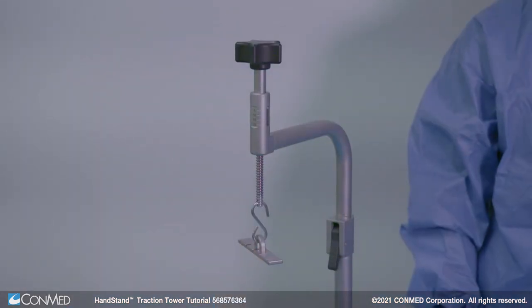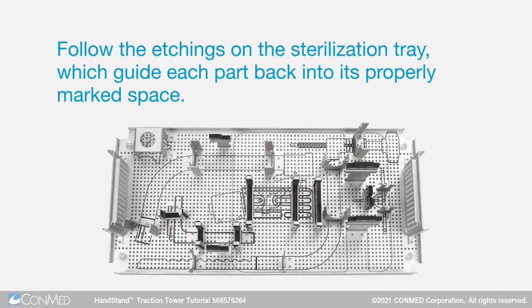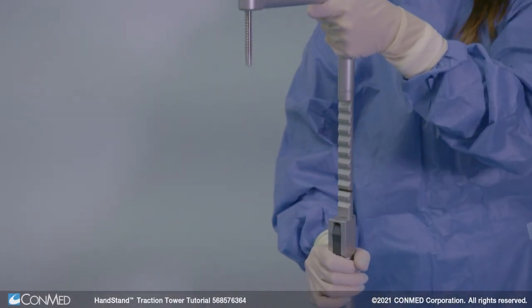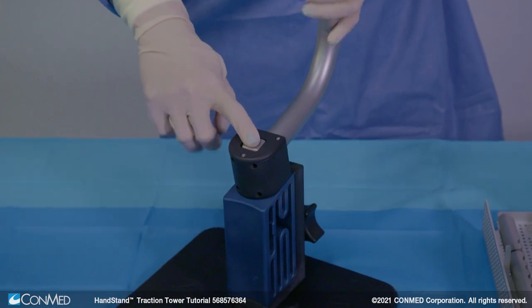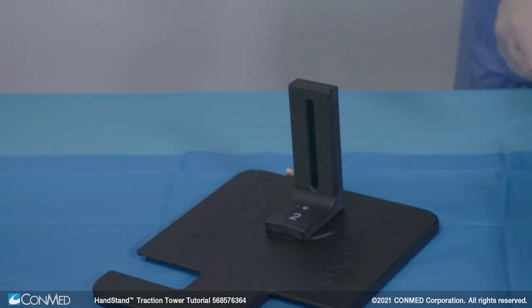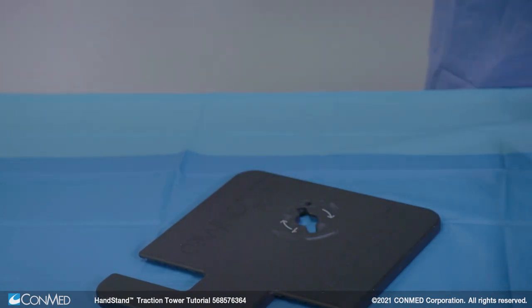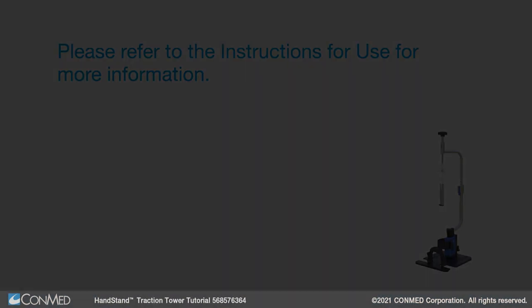To disassemble the tower, first remove the scale rack from the threaded rod in the upper arm. Follow the etchings on the sterilization tray, which guide each part back into its properly marked space. Next, depress the black lever on the lower arm and remove the upper arm. Then depress the silver button on top of the upper tower to remove the lower arm. Remove the tower locking knob, which releases the upper tower from the lower tower. Finally, pull on the silver locking pin on the side of the lower tower and twist to release it from the base plate. Please refer to the instructions for use for more information.